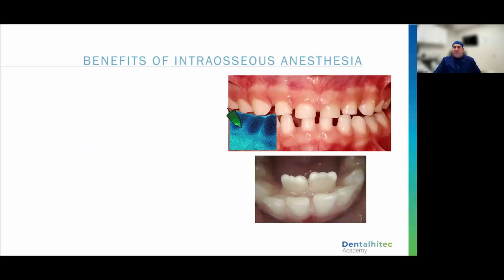For those of you who are new, we had maybe 8 or 9 of you that are new. Why do we do this? What's the point of giving anesthesia via the intraosseous modality? Number one, I say pain-free. I think we have to be careful using that term pain-free, but I will tell you that my experience is 8 out of 10 or 9 out of 10, and some days it's 10 out of 10.